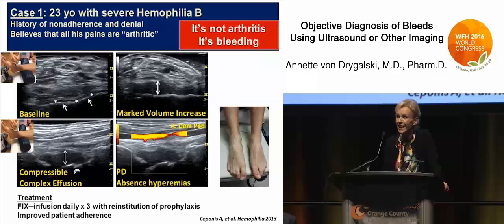And simply the engagement in front of the monitor and discussing all of this with him, I think, helped improve adherence. I also would like to point out, this is him on presentation. He had pain and some range of motion deficits, but just looking at those ankles, I don't think you could tell which one is bleeding. There was no warmth and there was no swelling.